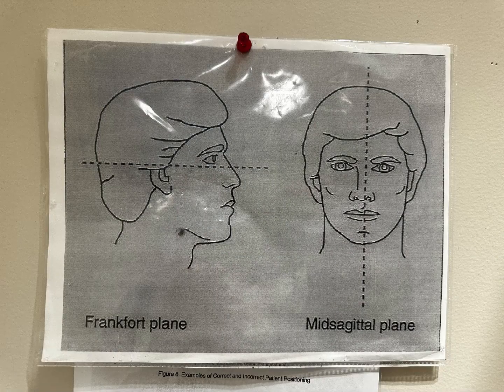First, we need to adjust the two perpendicular planes that are shown by the light on the mirror. The first plane is the sagittal plane. It is the term used to describe the vertical plane which runs down the middle of the patient's face, dividing it into two equal parts, and it should be positioned perpendicular to the floor.